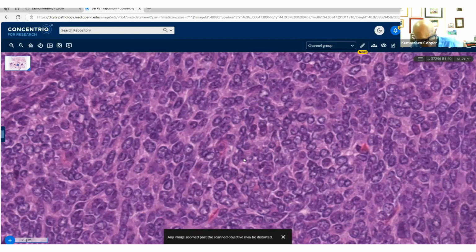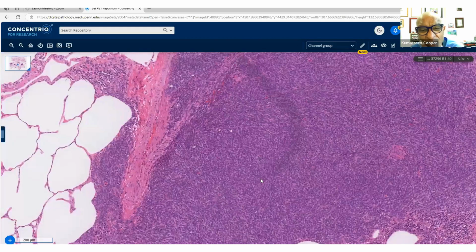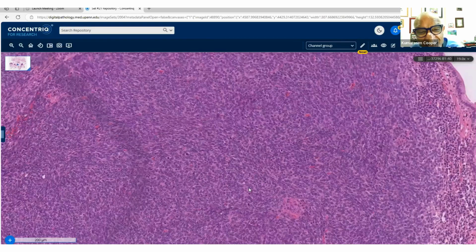Now, we do have FISH, and as you know, X18 is the translocation, and we have FISH to SYT, and this was positive. But you can get an antibody, specifically to one of those genes or to the entire chimeric protein, which is very useful. Brigham uses that all the time. So there are antibodies available which can help you in confirming this diagnosis as well.